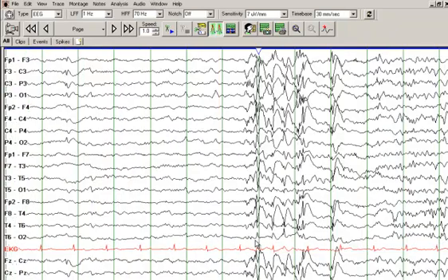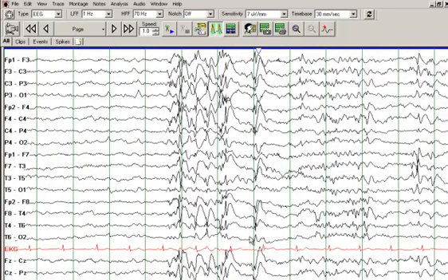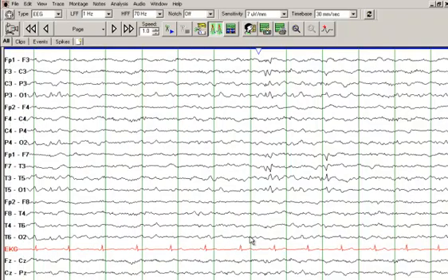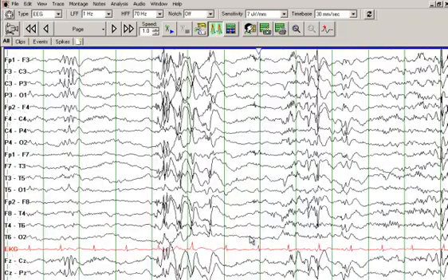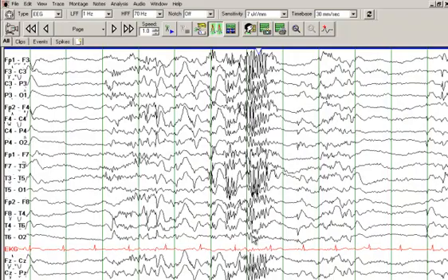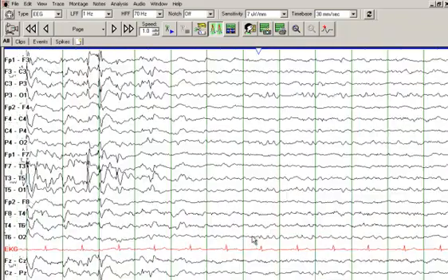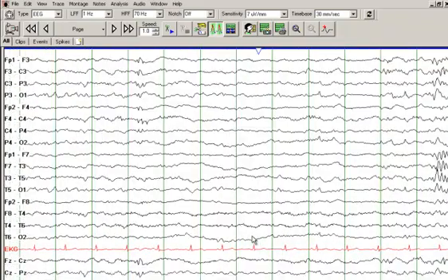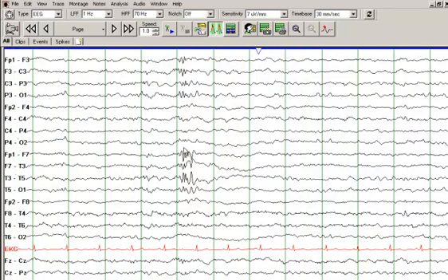The key features of Lennox-Gastaut syndrome are the multiple seizure types, cognitive delay, and slow spike-and-wave along with paroxysmal fast activity. More of those sharp waves are seen on this page, predominantly in the left hemisphere.